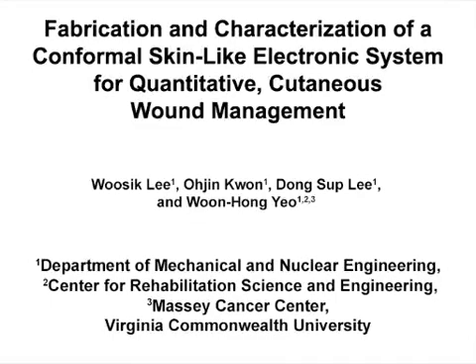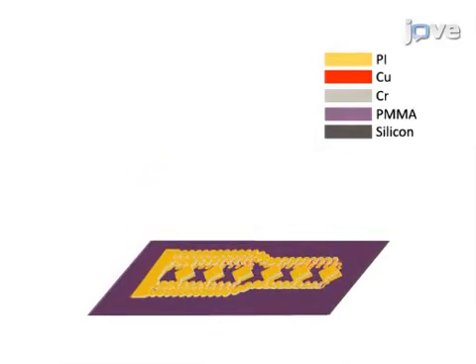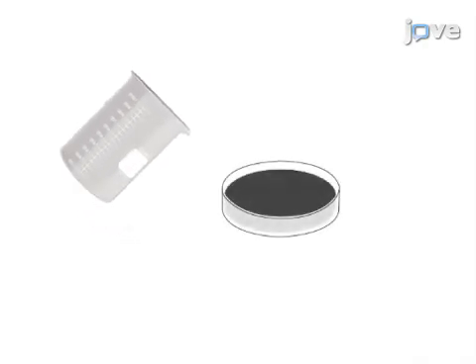The overall goal of this procedure is to fabricate a skin-like electronic device for quantitative cutaneous wound management. This is accomplished by first developing an electronic device on a carrier substrate. The second step is to prepare an elastomeric membrane to embed the electronics.